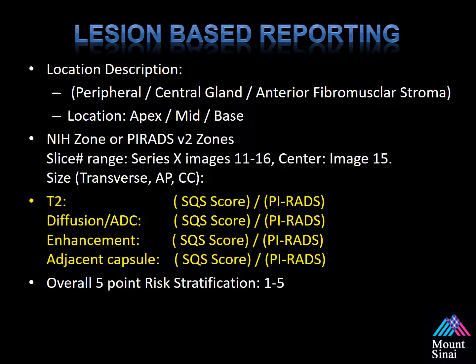First, you and your radiology team have to agree on a standardized reporting. Lesion-based reporting has been discussed in the new PIRADS 2 update, and this is what we used to perform at our institution. You should have a generalized location description. Where is it? Is it in the apex, mid, or base? We developed and used the NIH zones, but you can also use the PIRADS version 2 zones, which I'll discuss later, which are almost identical.